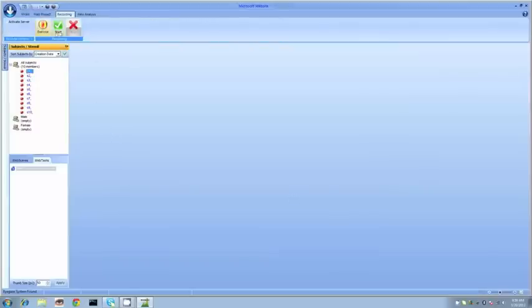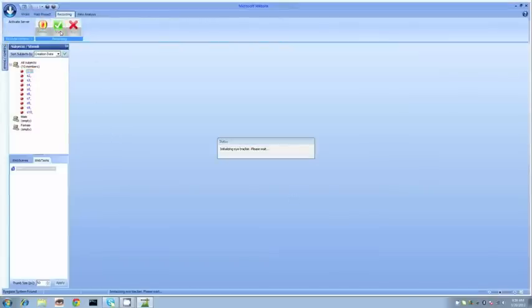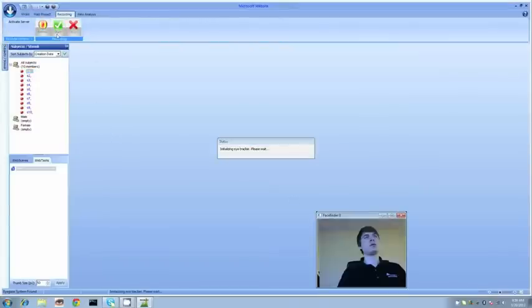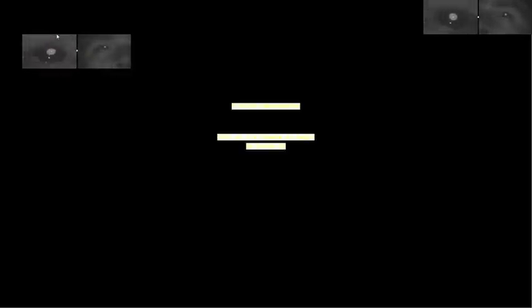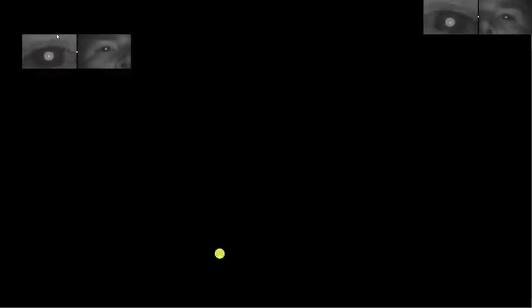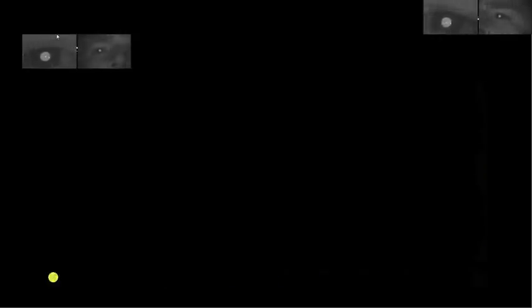The next step is we can just jump right into the experiment. I press record and this prompts the calibration procedure. This is going to take us just under 10 seconds. You can see my eye images in the upper right and left. I start the procedure and we're just going to follow this dot. The system is learning the shape of my cornea as I follow that dot around the screen.